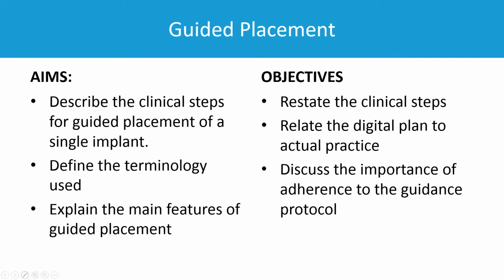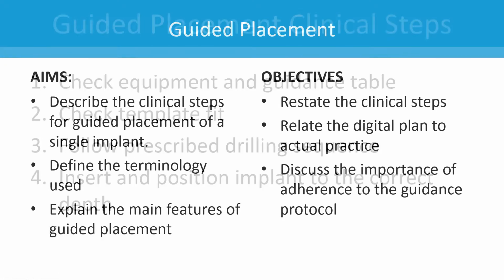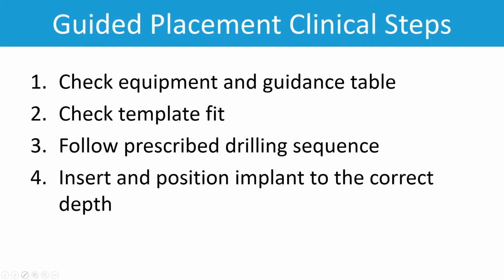So what are the main aims of this presentation and guided placement? Well, it's to describe the clinical steps for guided placement of a single implant, define the terminology used, explain the main features of guided placement. Hopefully at the end of this you'll be able to restate the clinical steps, relate the digital plan to actual practice, discuss the importance of adherence to the guidance protocol. It's most important that you follow the guidance protocol.